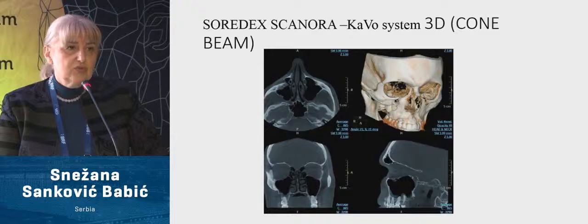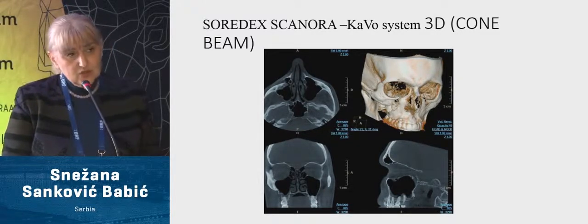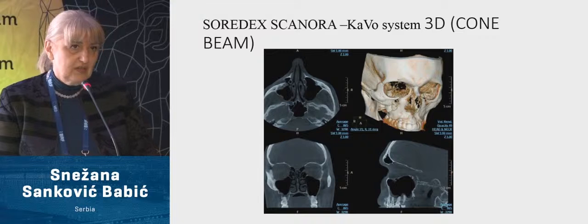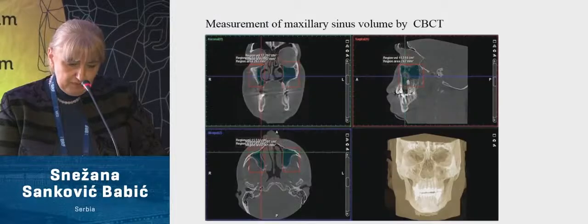Is it possible to achieve that golden standard with CBCT technology? The Scanora system, by our experience, gives excellent insight into all three sections. We can analyze 1 millimeter section slices if we want to go thoroughly through the whole sinus volume.